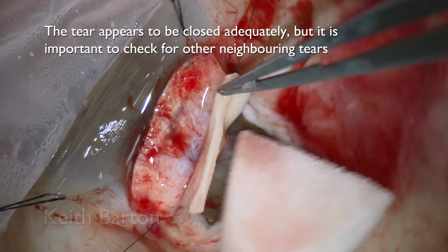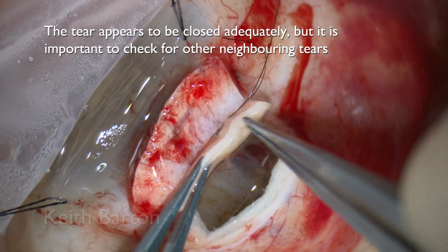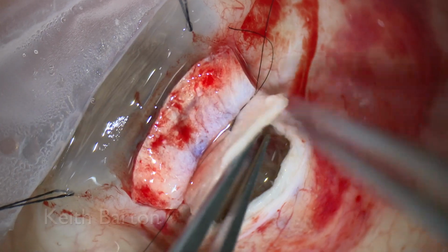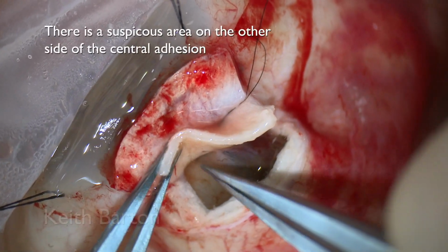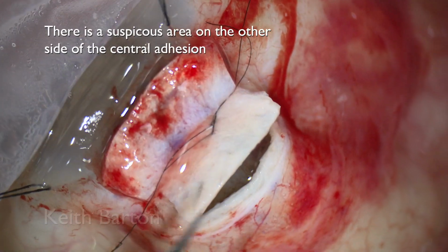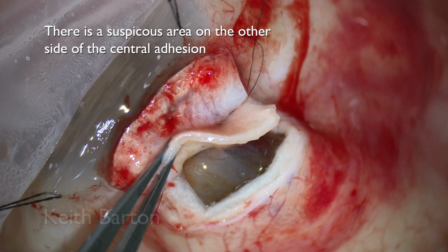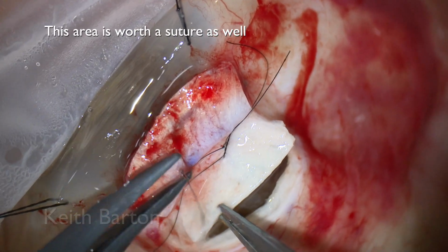The tear appears to be closed adequately, but it is important to check for other neighbouring tears. There is a suspicious area on the other side of the central adhesion. This area is worth the suture as well.